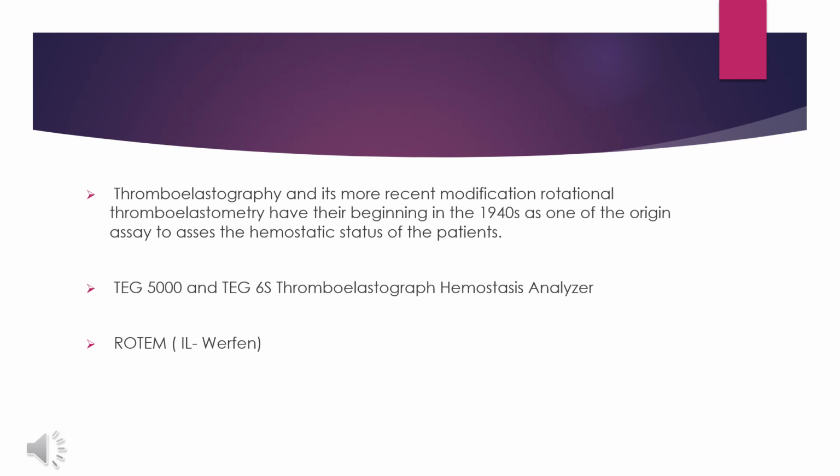So the TEG and the ROTEM are mainly used in liver surgery, cardiac surgery, and trauma.